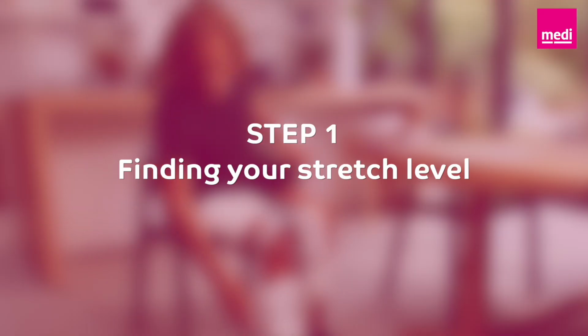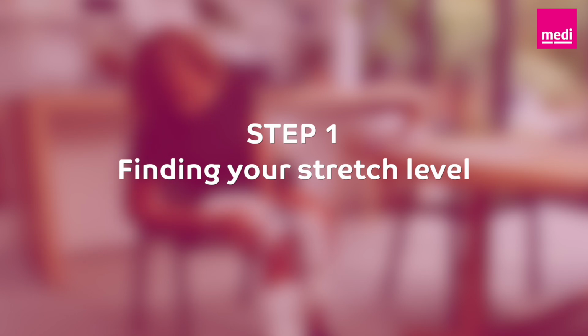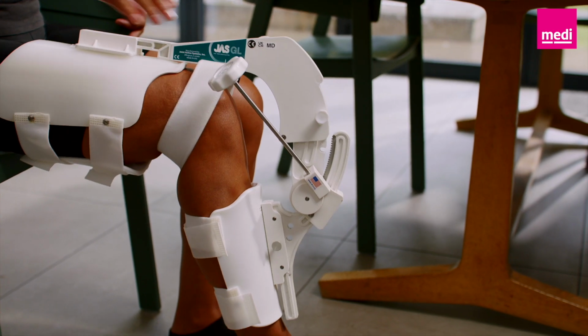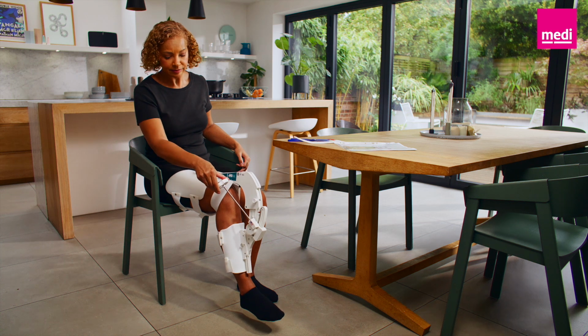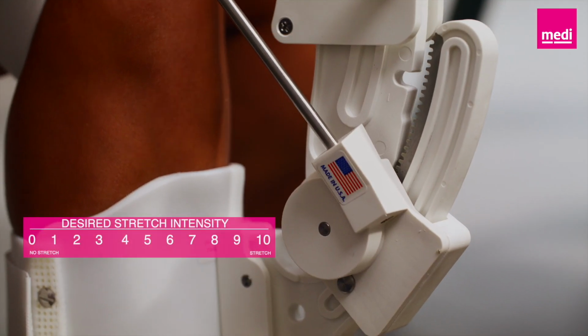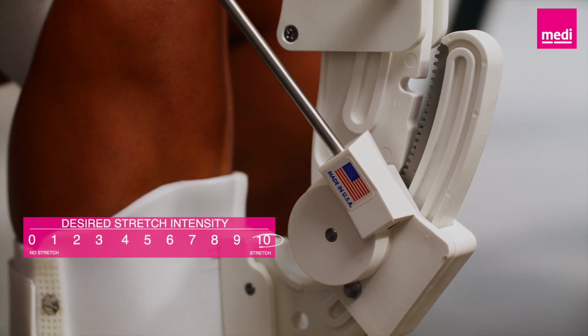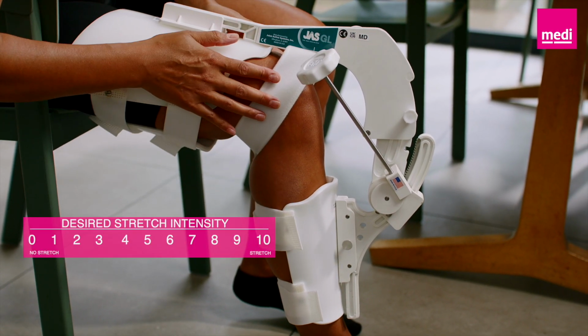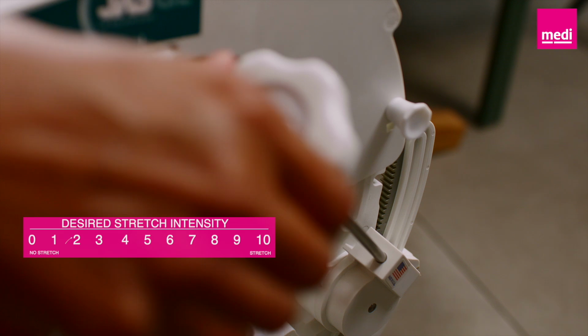We'll now go through each step of the JAS therapy session, starting with Step 1. Finding your stretch level. Before you start your session, turn the therapy knob until you feel a gentle, pain-free stretch. Use the stretch scale from 0 to 10, where 0 means no stretch and 10 is a stretch that causes pain. For the best results, aim for a gentle stretch level of 2 or 3 on this scale.